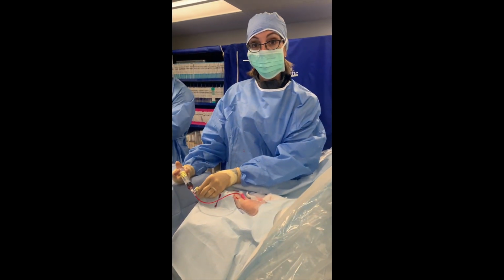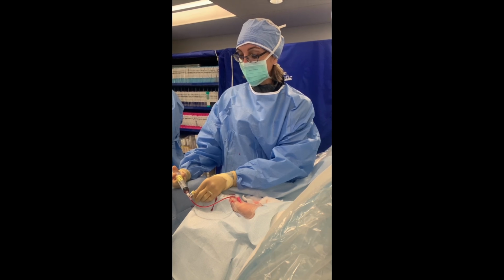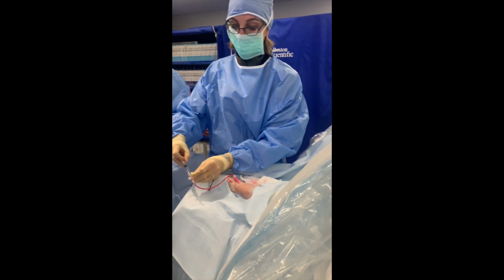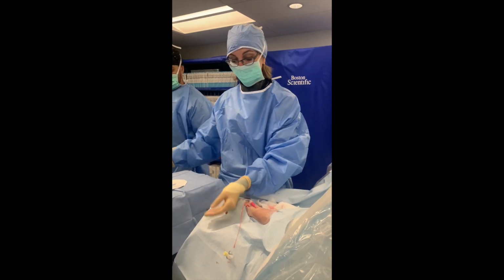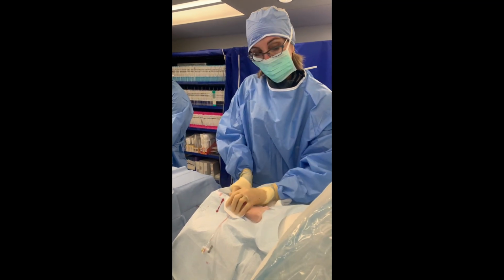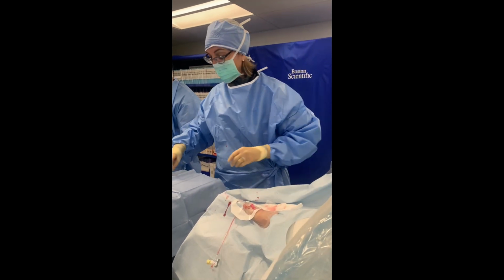So everything's going great. We do this nice and slow. The access was so slick, and then the sedation, Nikki, is so good. What did you give her, Nikki? Given her some Benadryl, 25 milligrams, and then I gave her 1 of Versed and 50 of fentanyl. So there was just a little warm. What is that? A little warmth is probably just the vessels of the hand dilating.